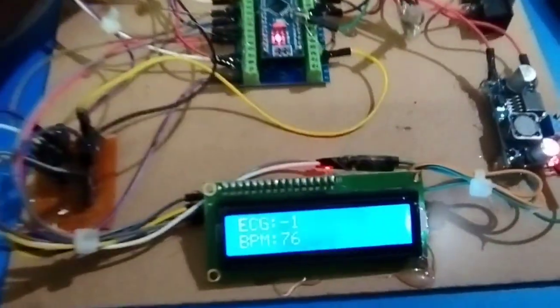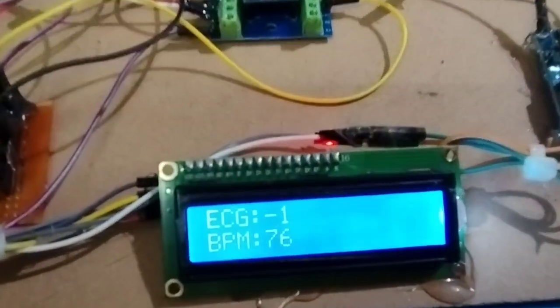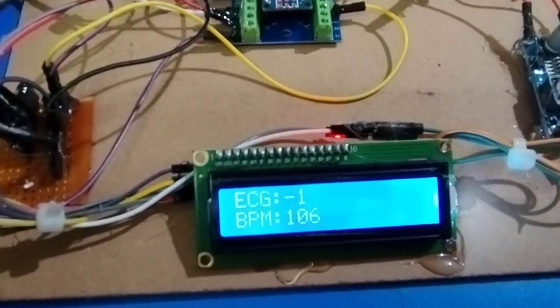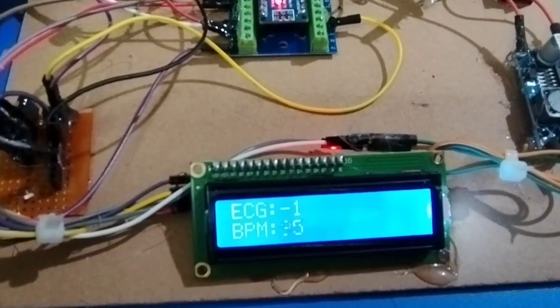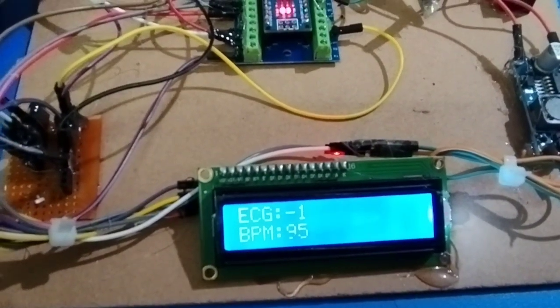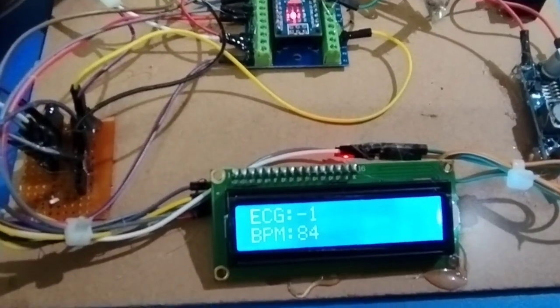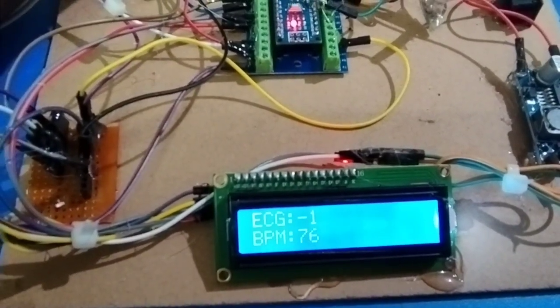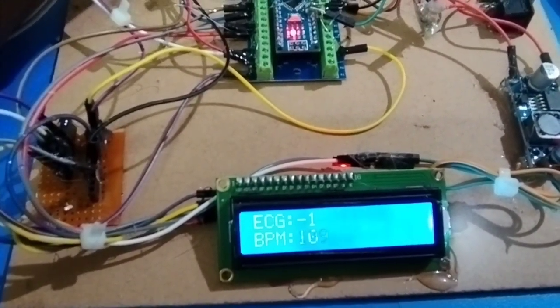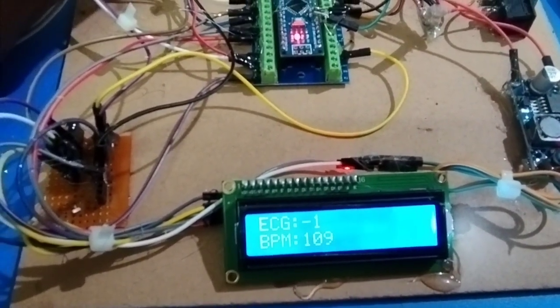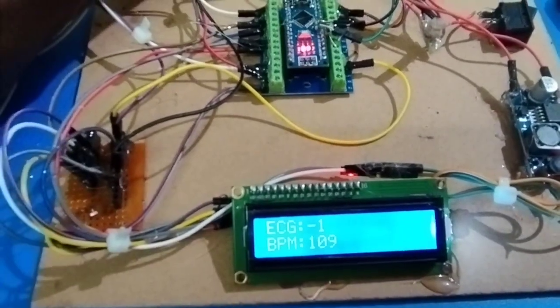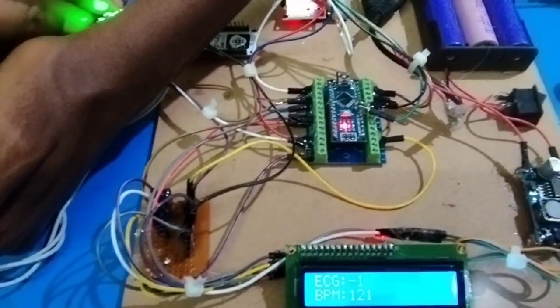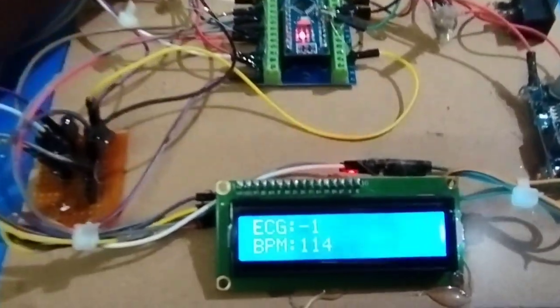We are getting the BPM data as 76, 95. Actually it should be around 60 to 70. We need to wait till it gets exact values. Maybe we have to place it properly so that we will get exact data.